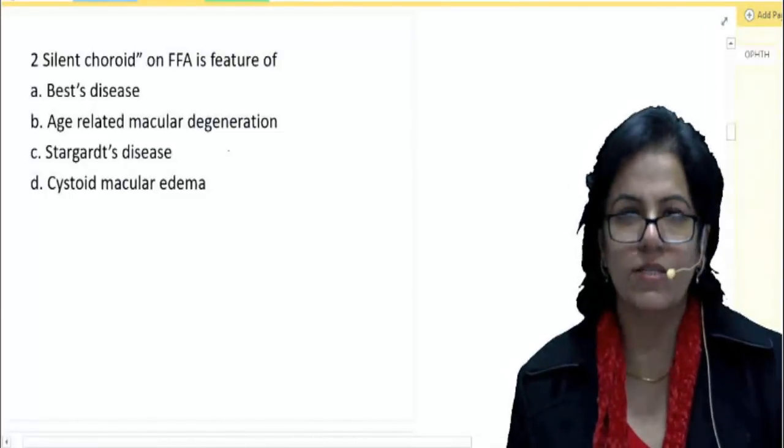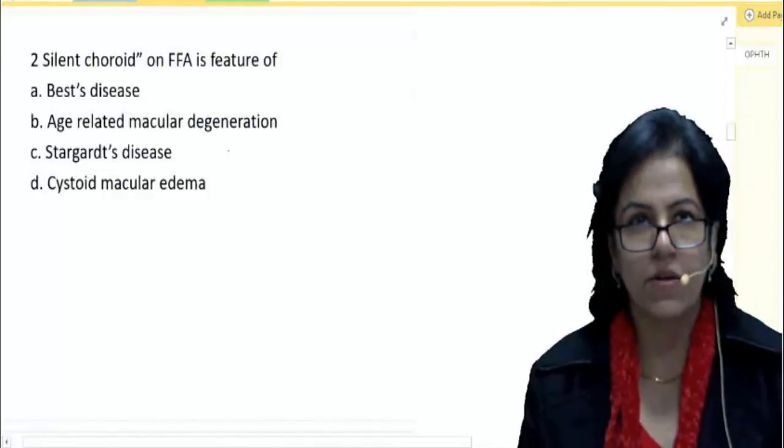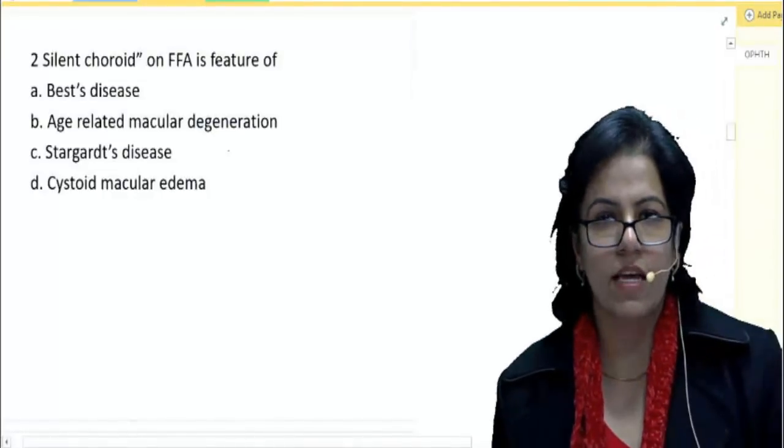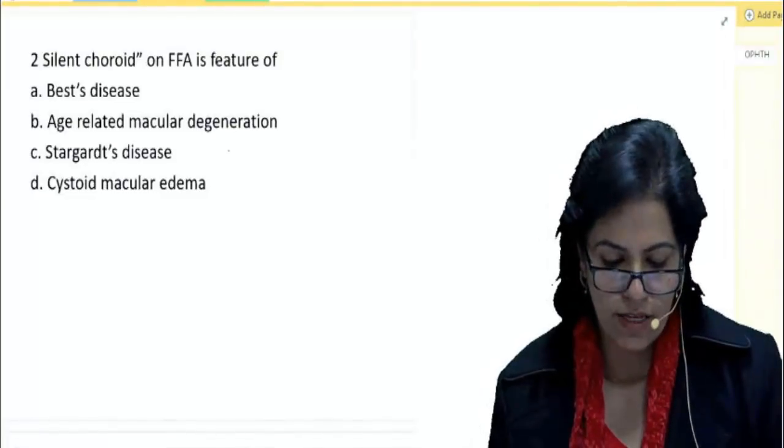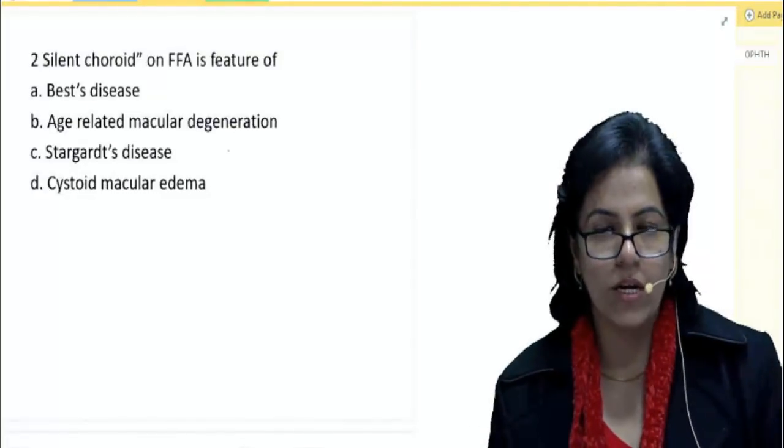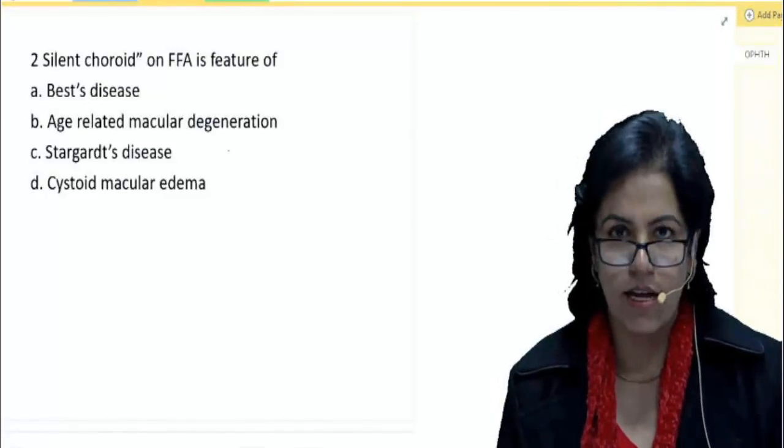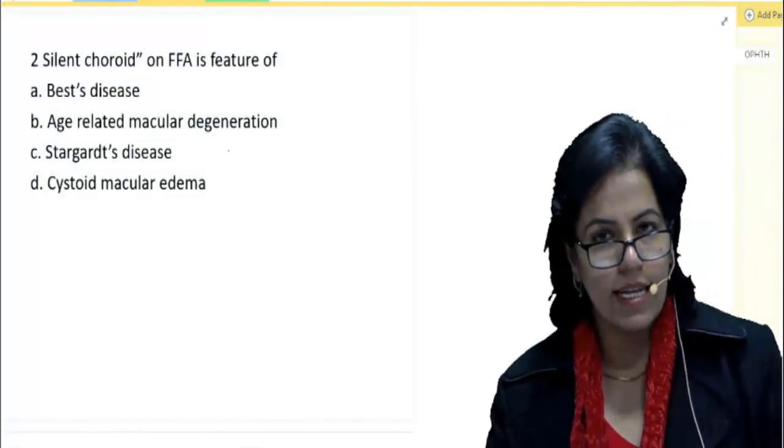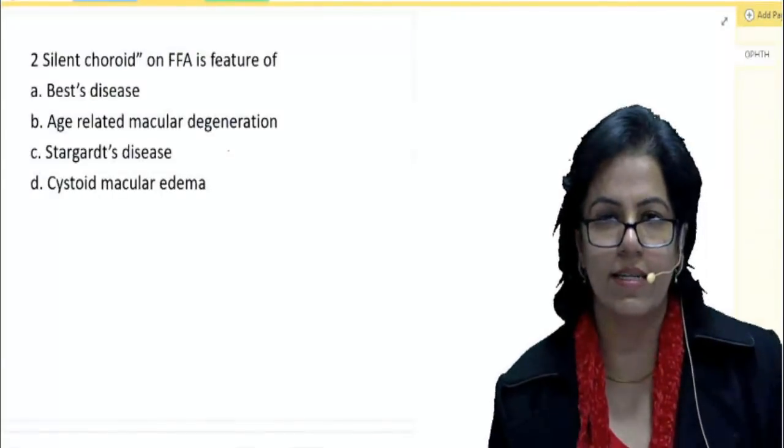What is silent choroid? Silent choroid on FFA—I hope you all know is fluorescein angiography—is a finding which means that the choroidal fluorescence is totally not seen. It is dark background and against that dark background, we are able to see prominent retinal blood vessels.